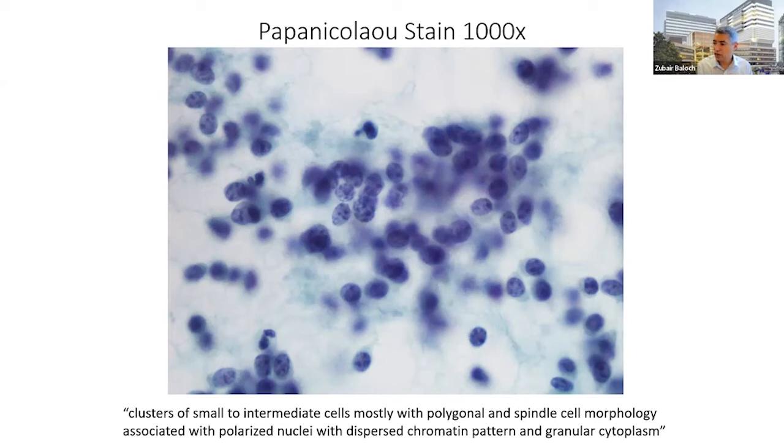But from a cytology point of view, because this is much more of a serious diagnosis that you're making, it's always good, if you do not have a good cell block, to do immunostains or to get serum calcitonin levels to really confirm it. And also now you can send a part of the aspirate for calcitonin level determination. So this is actually a very classic picture of what is called the epithelioid type of medullary carcinoma, which is the most common cell pattern.